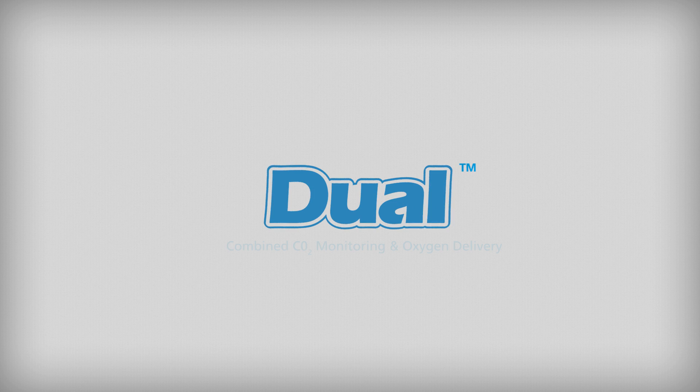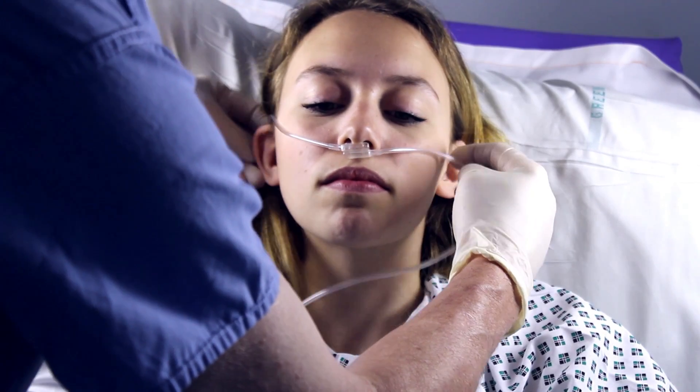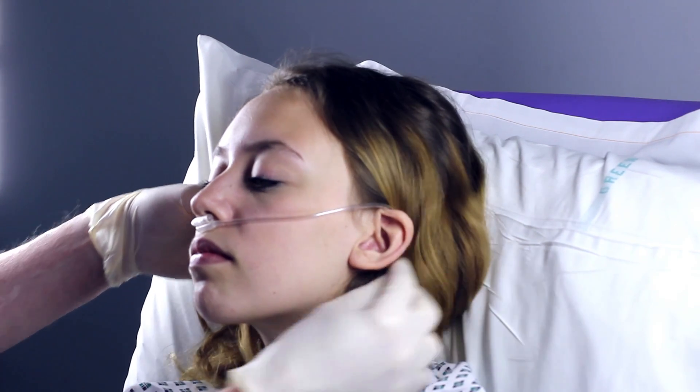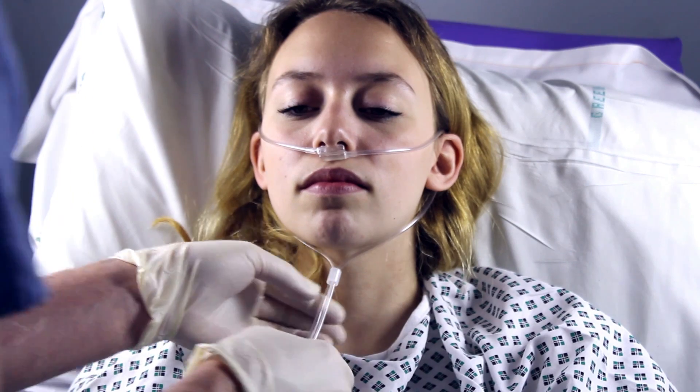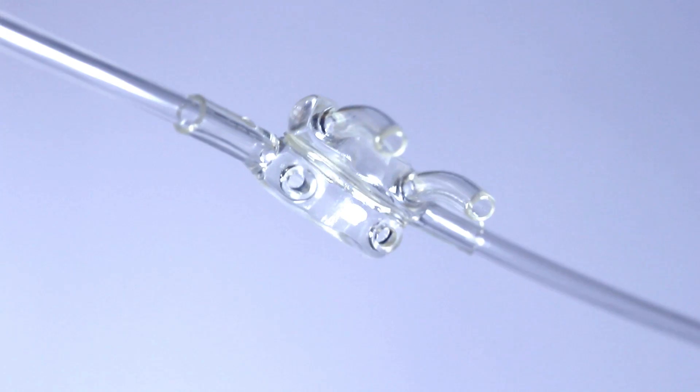The dual nasal cannula is designed to provide oxygen to both nostrils and also sample CO2 at the same time. The CO2 sampling is taken from both nostrils, and there is no risk of mixing with fresh oxygen, as the patient's expiratory flow will divert fresh gas away from the sampling prongs. CO2 is sampled from both nostrils for sidestream CO2 monitoring through the upper prongs.